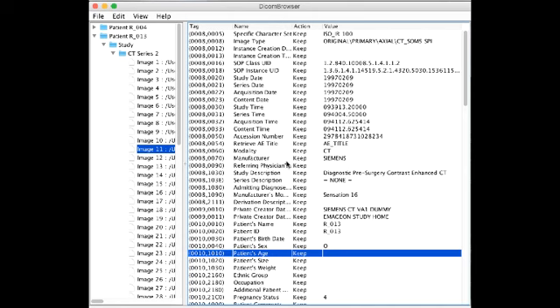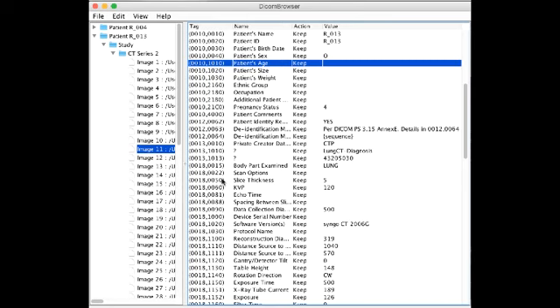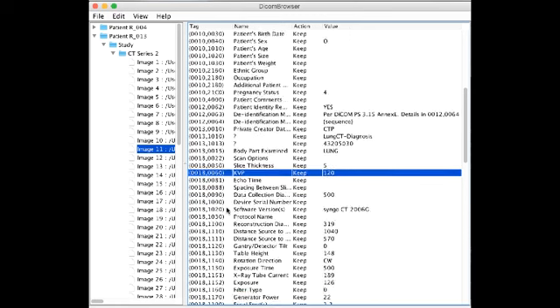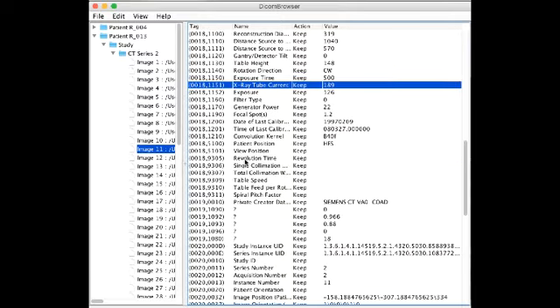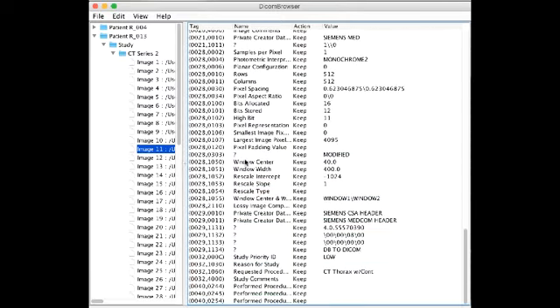You can also see parameters about the scan itself. So if we scroll down, you can see the slice thickness of the CT, the kVp that was used, and down here I think we can see the mA, the X-ray tube current, and other parameters of the scan. So there's lots of useful information here for interpreting the study.